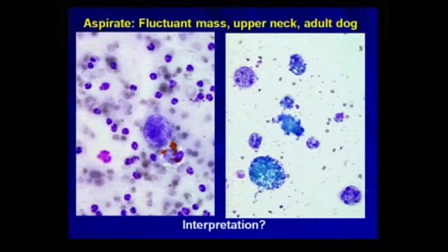I will tell you right now, this is from 2 different cases that I've seen in the last year, but I wanted to point them out because I think that they're fairly diagnostic, and not all these cases look alike. On the first case, what is the predominant cell? On the left, well, it's a neutrophil, so we are dealing with inflammation.